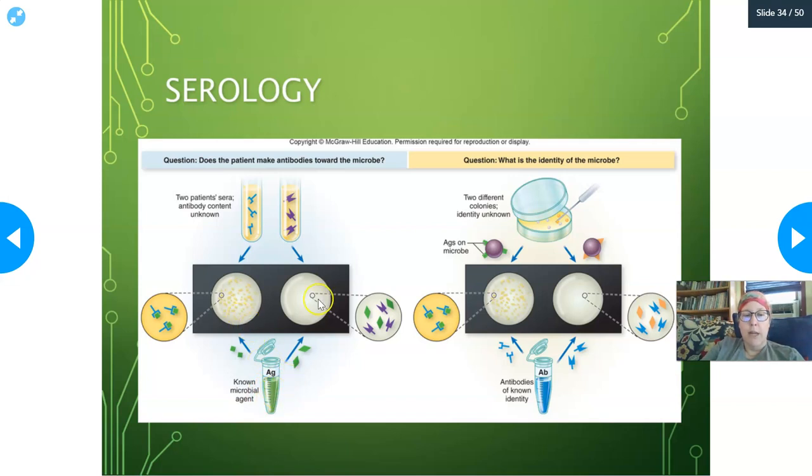And so you mix them. So you put the antigen there, and then you put the antibody from the patient in each of the wells there, and then you mix them, and you wait for it to react. Usually these antigens are actually coated on like latex particles and stuff like that. If the antigen is there and present, and if the antibodies are present to that specific antigen, those antibodies were anti-cryptococcal antibodies, they will react and cause clumping that becomes visible to the naked eye.